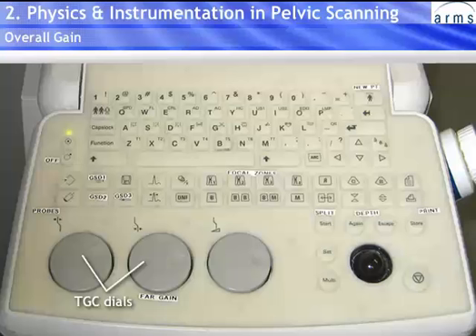Ultrasound systems usually use a series of slide switches or knobs to control time gain compensation. The position of a particular switch or knob corresponds to the part of the image that it affects. Generally, the TGC switches corresponding to progressively deeper areas of the image must be positioned further to the right to create a smooth, uniform image.